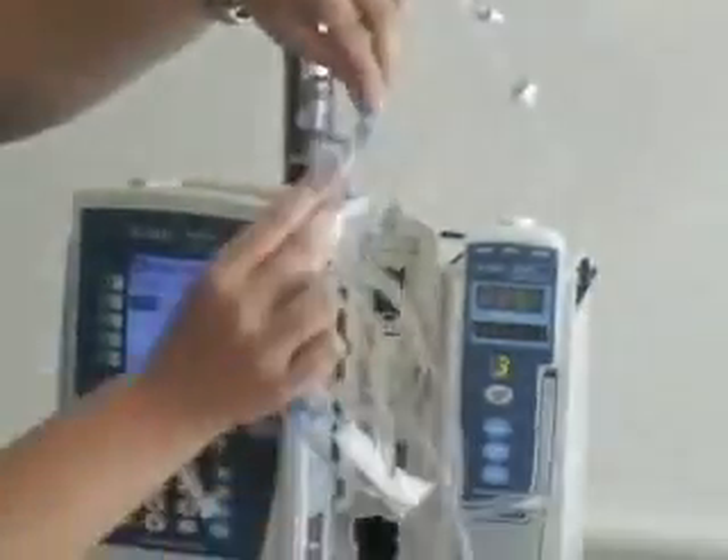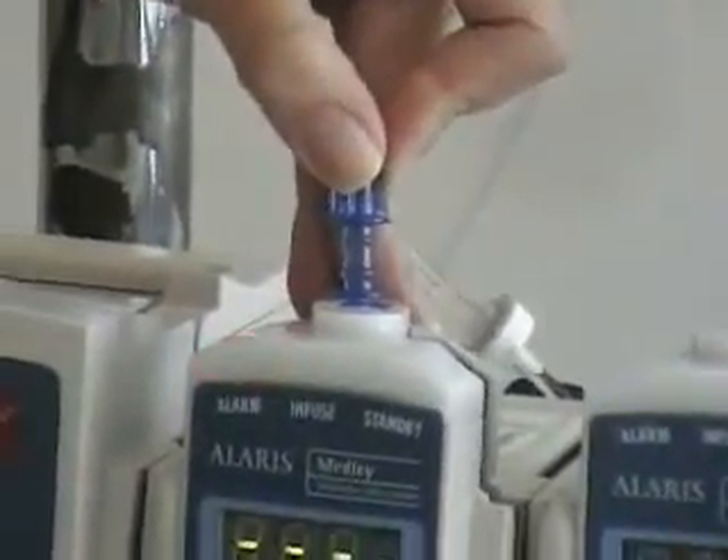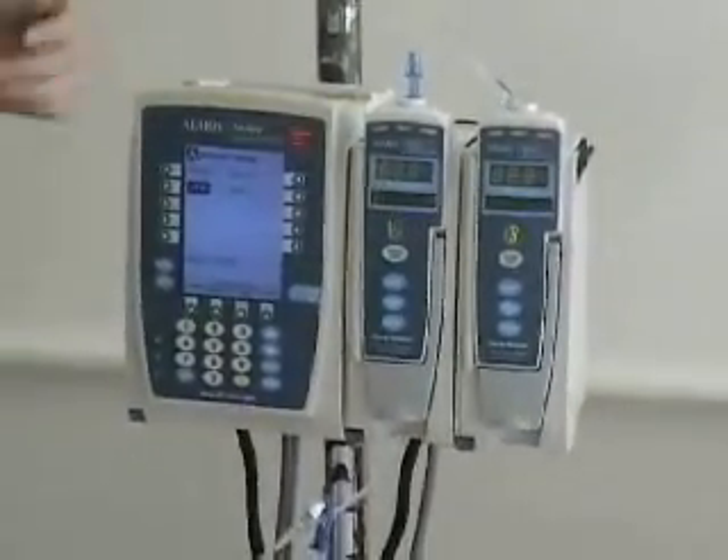This right here goes on top, and this is like a little card that goes right into the bottom here. Then you close the door — it'll click deep and actually be really loud. And that's how you put the IV tubing in.